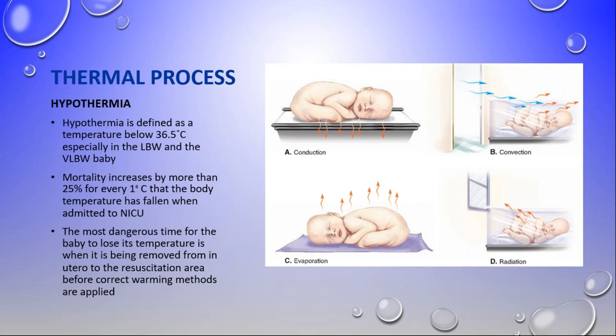Also, that your equipment is working. Is the resuscitator or the overhead heater working? Is it working properly? Are our probes put on correctly? It is very important because, remember, neutral thermal environment means the baby is using the least oxygen and the least glucose to sustain life. What equipment do we need?